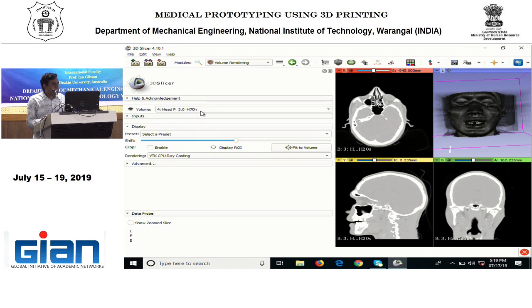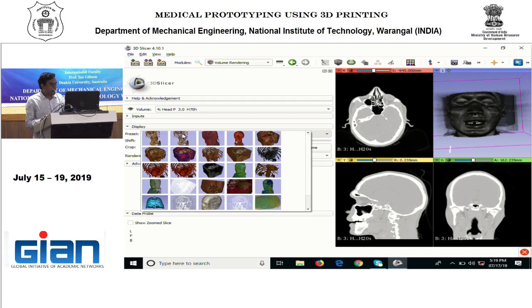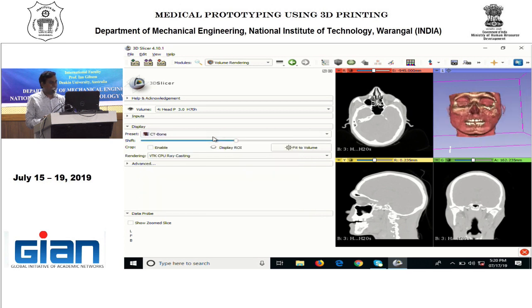Next, you can see here the head. Now go for the select. Here you can take different bone and tissues. Suppose I am clicking here, you can see CTA. Suppose here CT fat, here the CT liver. You can take different organs. Whichever organ you have to take, you have to click it. Here I am taking the CT bone. So now I am clicking CT bone.